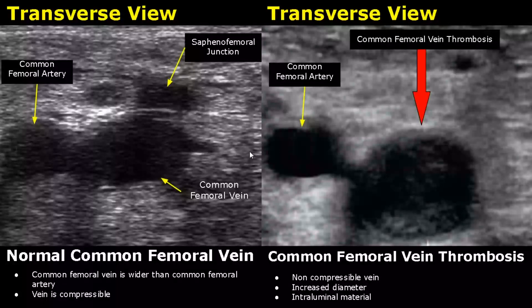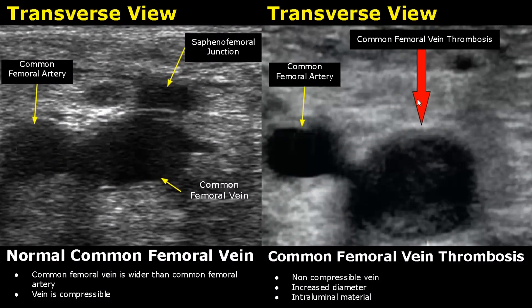Here we see a thrombus in the common femoral vein. The vein will be non-compressible, which means when we apply pressure from the probe it will not collapse. The diameter of the vein will also be increased. The lumen is filled with some material — that is the thrombus.